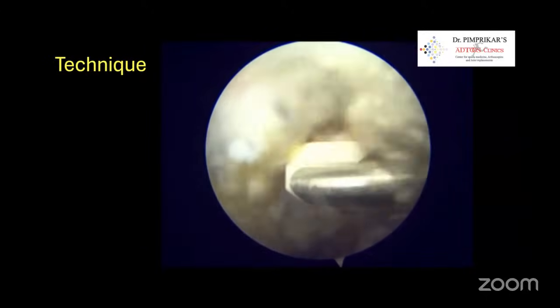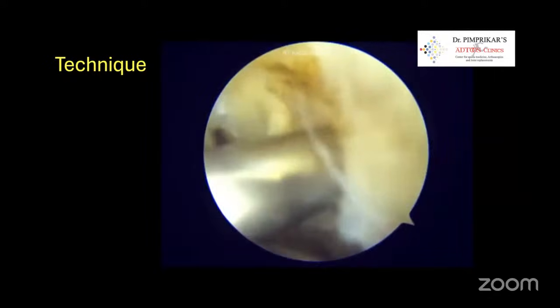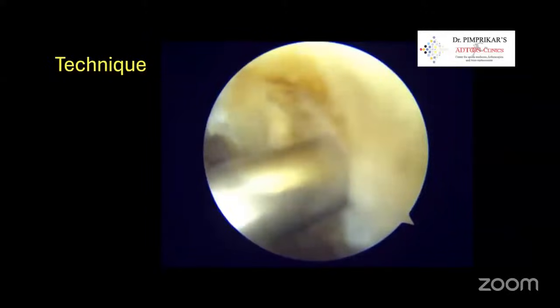Now that's the anatomy on the femoral side, and that's the part where I would like to put my femoral tunnel, which is kissing the articular cartilage, and it is exactly at the medial arch point. It is done in a similar way as you do it for the ACL, but we do it at 90 degrees of knee flexion here. I operate in a TKR position.